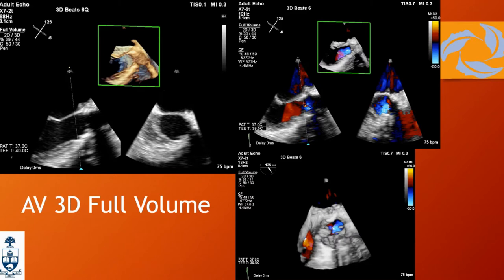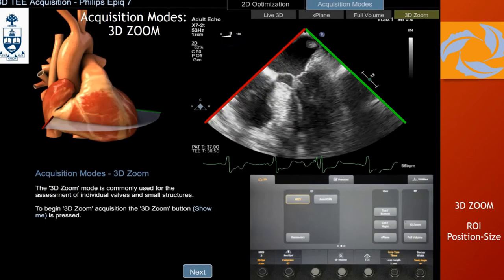More examples from the aortic valve — you go to the long axis or short axis; as long as you get enough elevation, you'll include everything. If you take it from the short axis, you'll get both views accordingly. You can add color, and then do many things afterwards like tracing the valve area. For full volume with 3D color, it's my personal recommendation: full volume with the image cropped to a minimum gives the best quality image, better than 3D zoom or live 3D.